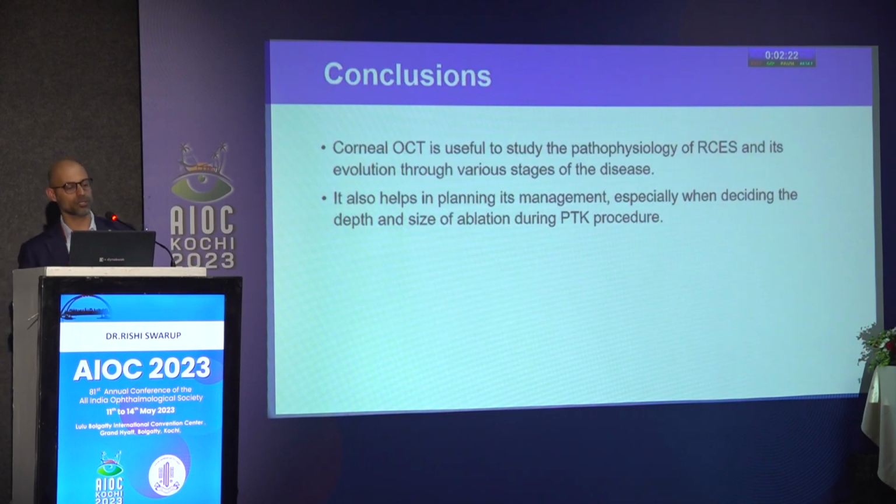So to conclude, corneal OCT is useful to study the pathophysiology of recurrent corneal erosion syndrome and its evolution through various stages of the disease. It also helps in planning its management, especially when deciding depth and size of ablation during a PTK procedure. Thank you.